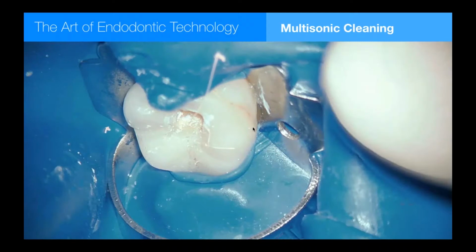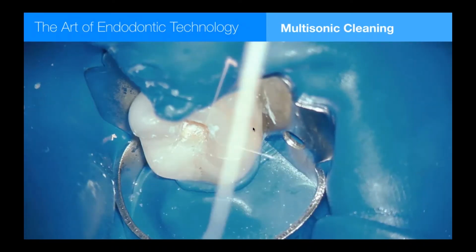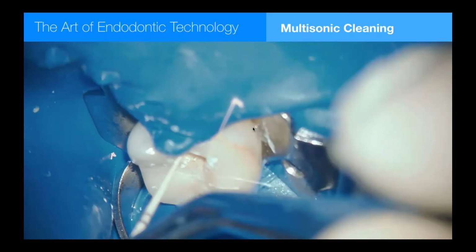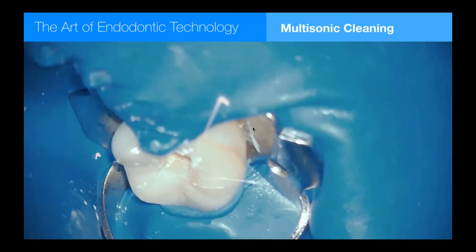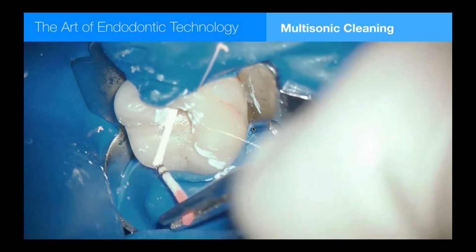Because I'm using carrier-based obturation here, I'm going to dry the canals and then coat the coronal half of the canals with, in this case, BC Sealer, a heat-resistant form of that. And a little second application just for good form.